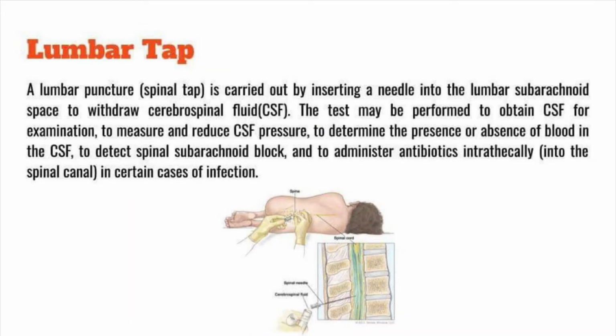Lumbar tap, or a lumbar puncture, is carried out by inserting a needle into the lumbar subarachnoid space to withdraw cerebrospinal fluid, or CSF. The test may be performed to obtain CSF for examination, to measure and reduce CSF pressure, to determine the absence or presence of blood in the CSF, to detect spinal subarachnoid block, and to administer antibiotics intrathecally, or into the spinal canal, in certain cases of infection.